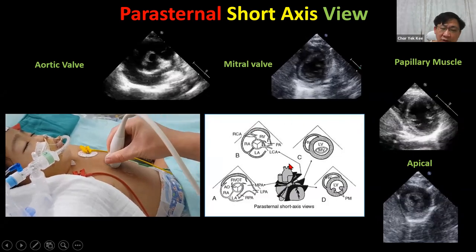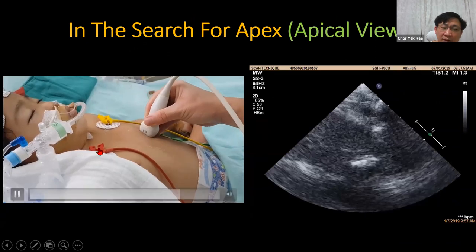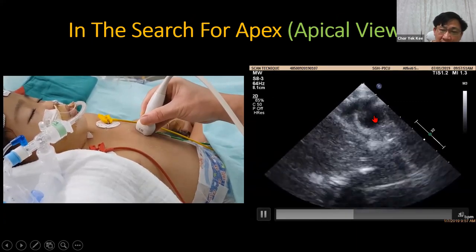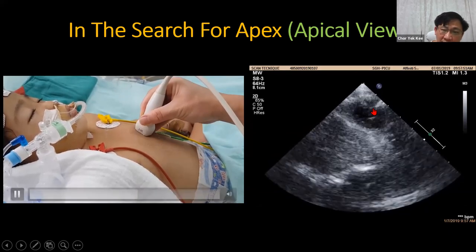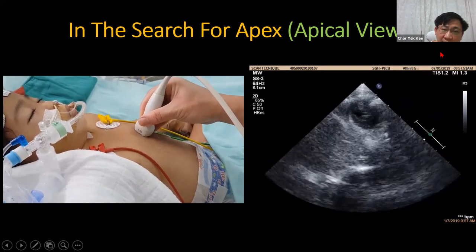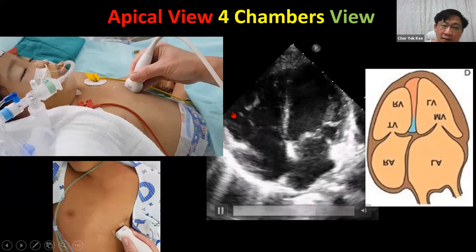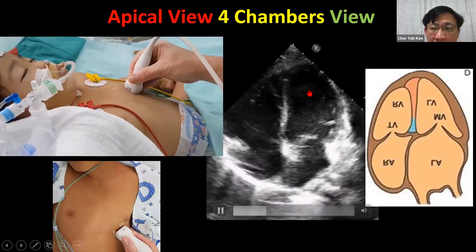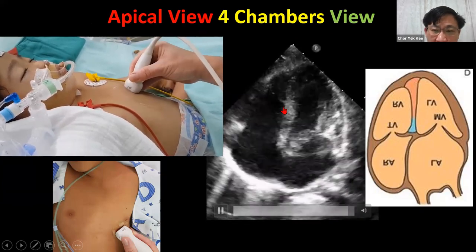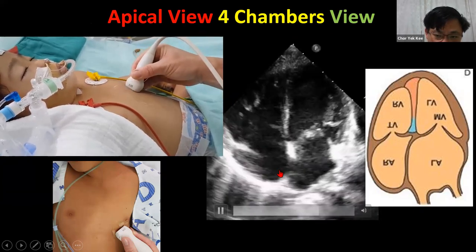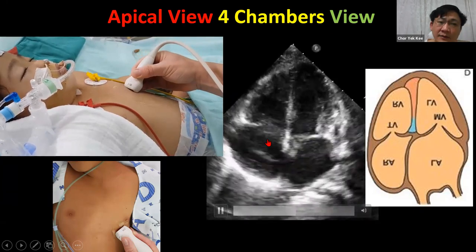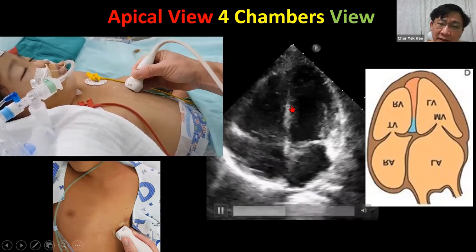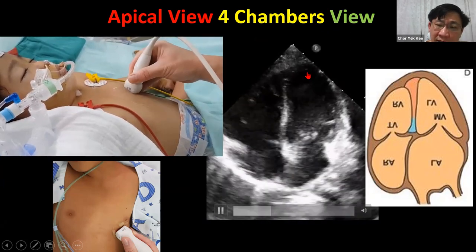After the short axis, migrate your probe slowly to the apex of the heart. Once you see the apex, tilt upwards. This gives you the apical four-chamber view. Four chambers: left ventricle, left atrium, right ventricle, right atrium. The center is the ventricular septum, then the atrial septum, and you can see the mitral valve. In this view you can observe both left and right ventricle, see how they interact, and check the atrial septum for any deviation.